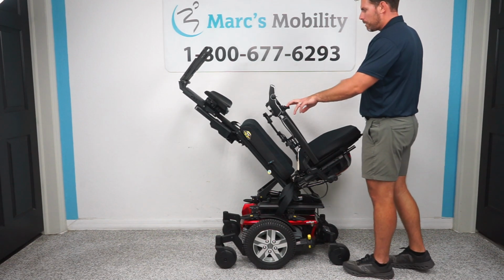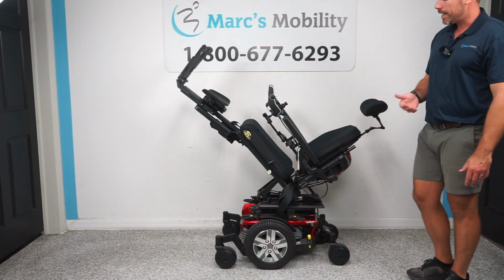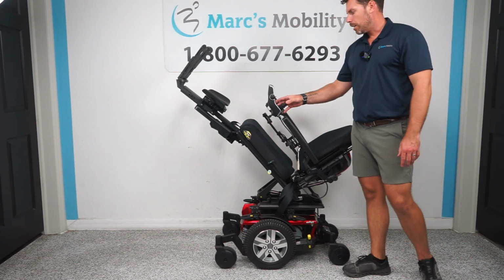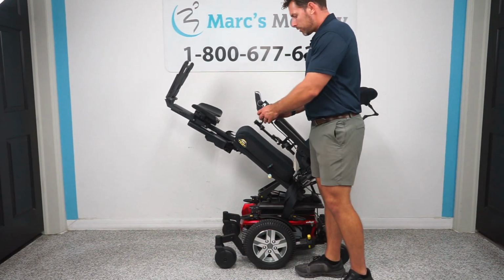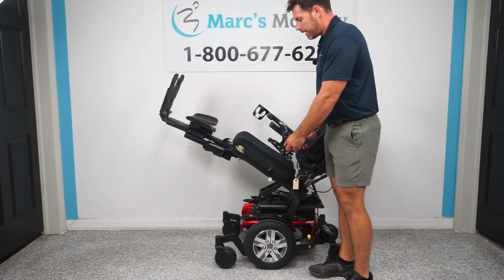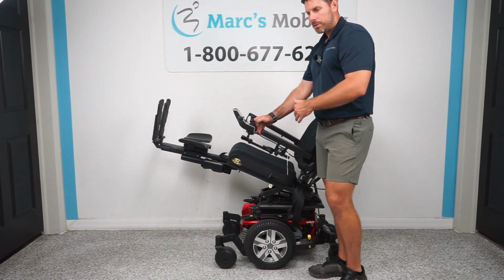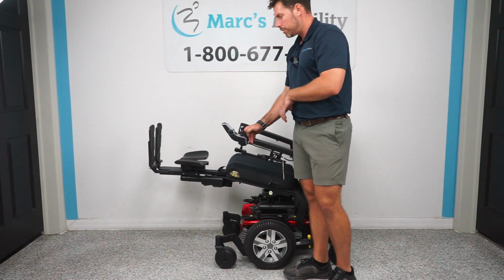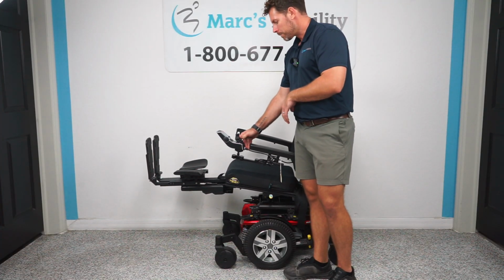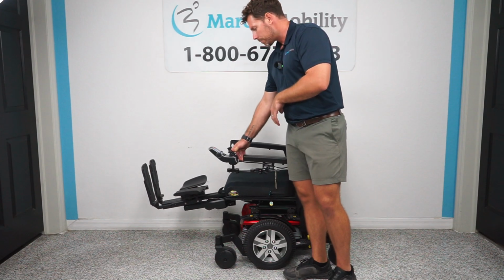So this is what you're pretty much going to be looking at here if you had your electric tilt and your electric legs activated at the same time. Now I'm going to go ahead and bring the electric tilt back down and go over a few more things. This has a swing away joystick where the joystick can swing away to the side of the chair. What that does is that helps you be able to pull up closer to a table and or not have obstruction in front of the armrests if you want to push off of those to get in or out of the unit.